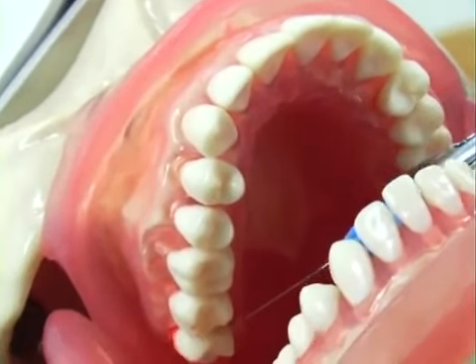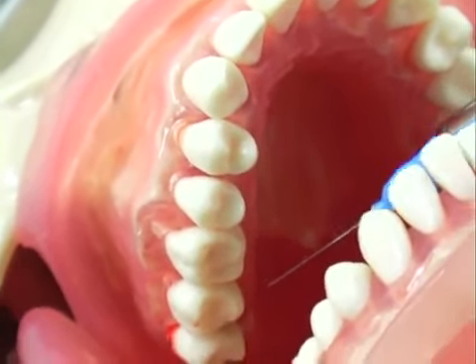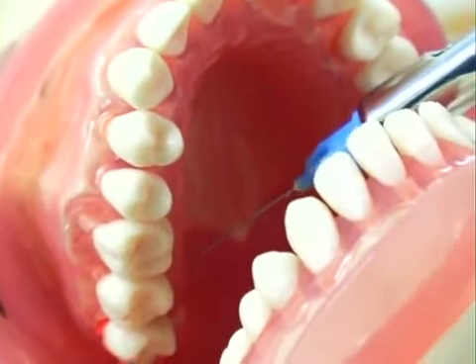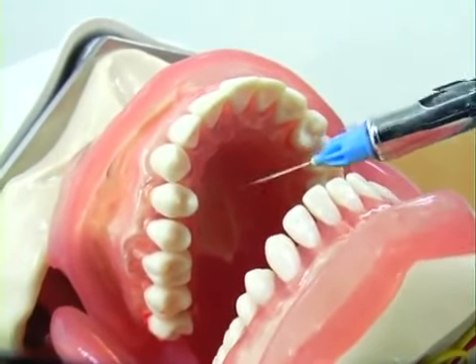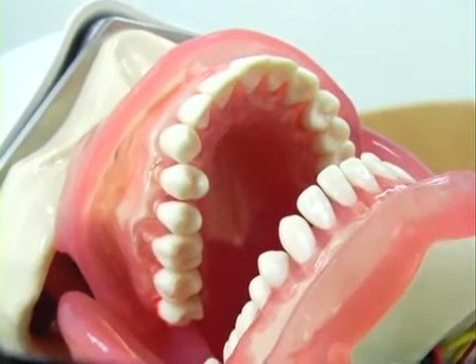As I mentioned earlier, you should not go beyond the distal surface of the 7, which means that anesthesia of the lesser palatine nerve can occur and can cause gagging of the patient. So you should try to remain anterior to the distal surface of this 7.